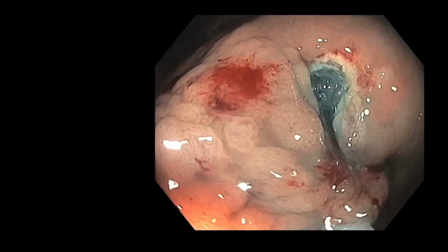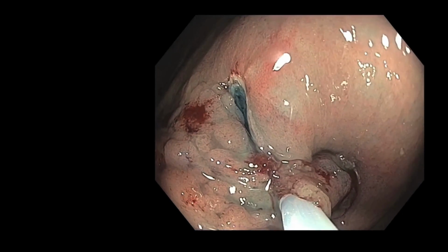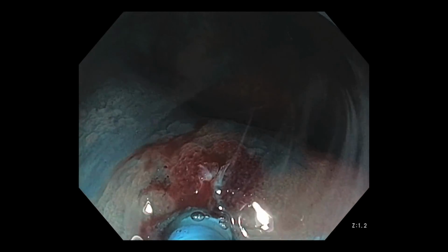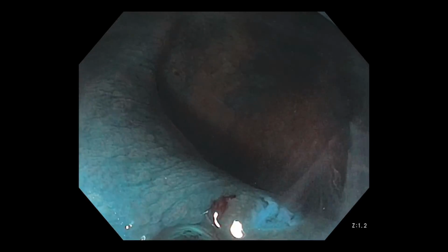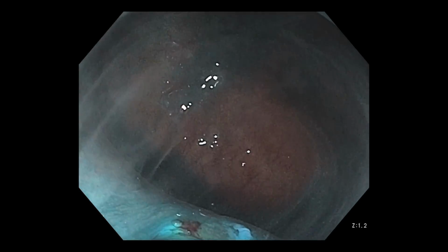Endoscopic submucosal dissection may be necessary for complete resection. Here is a nonpolypoid neoplasm in the rectum of a patient with long-standing ulcerative colitis. Significant fibrosis is present at the lesion. Endoscopic submucosal dissection is necessary in such cases to complete resection.